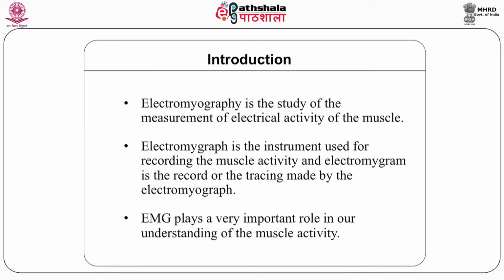Electromyography is the study of the measurement of the electrical activity of the muscle. Electromyograph is the instrument used for recording the muscle activity, and electromyogram is the record or the tracing made by the electromyograph.